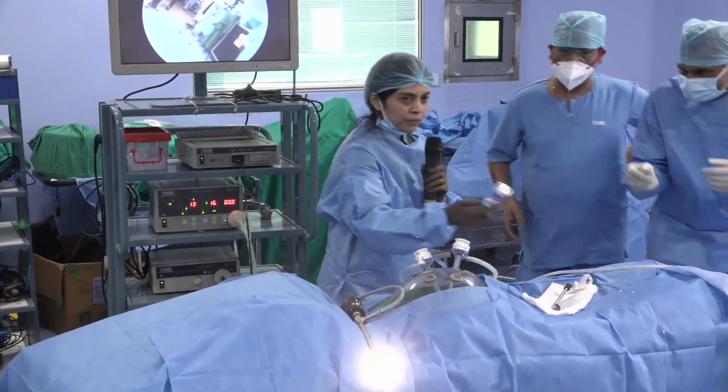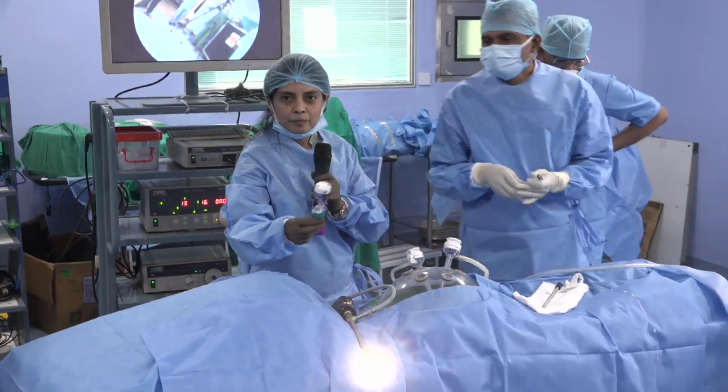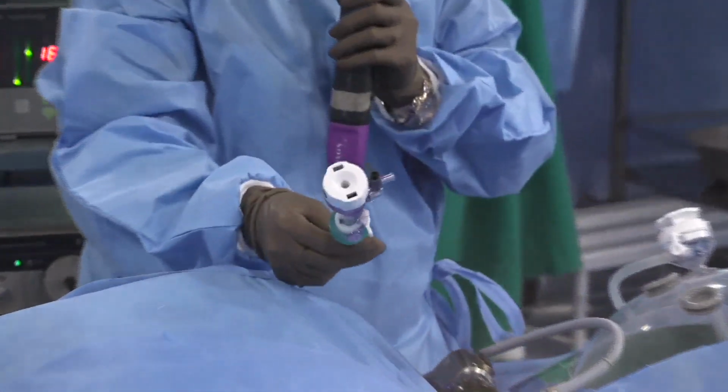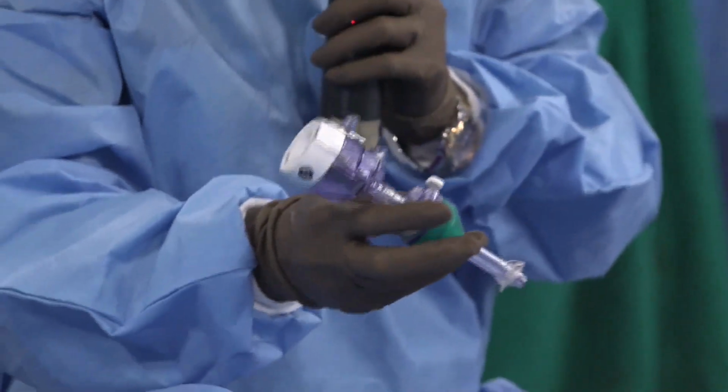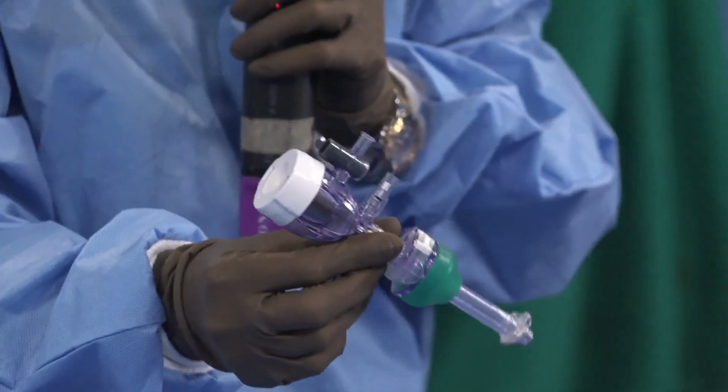And can you focus on this? Just bring it down here. So this is a balloon port. Okay, so you will see how the balloons inflate once we inject some air.